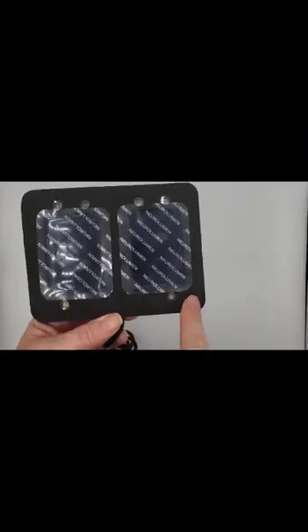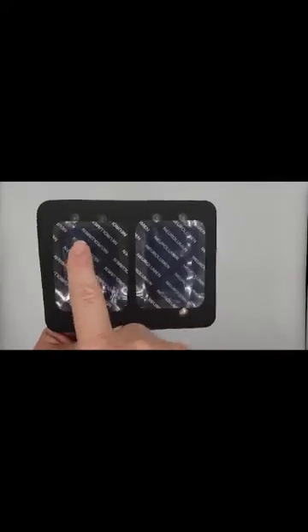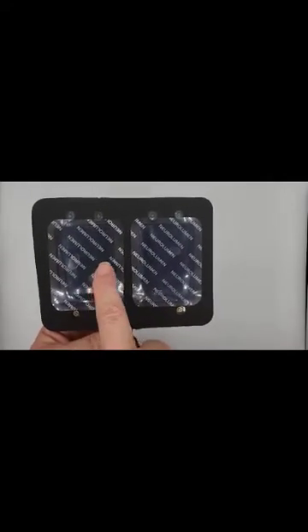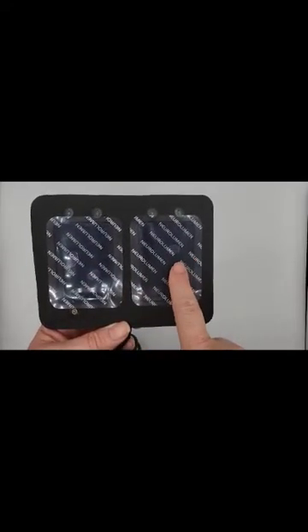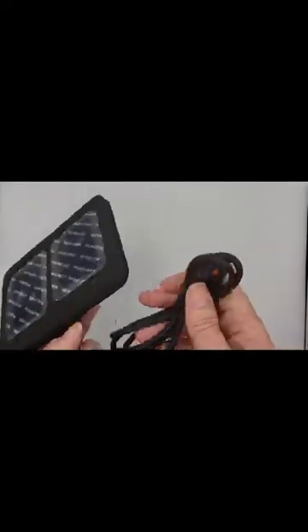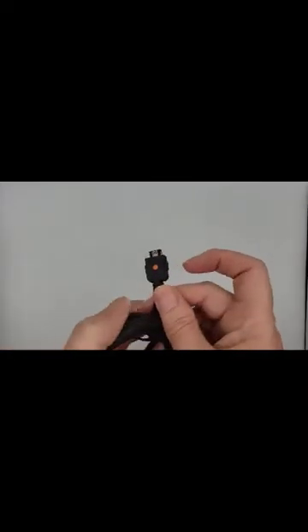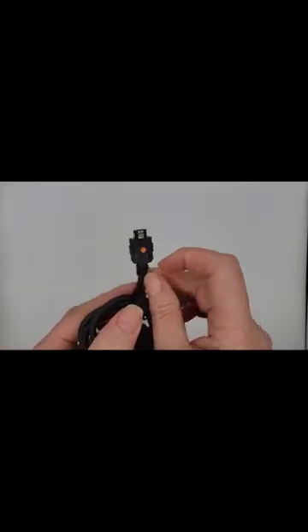There are lights and lasers on your treatment pad that will turn on automatically. The two together on one side are the lasers, which you will see dimly light up. The 4 on the top are the infrared LEDs, which will be invisible to the naked eye, and the bright red LEDs. All of these are set to the perfect wavelength and cannot be adjusted. In the middle are the gel pads and clear covers.